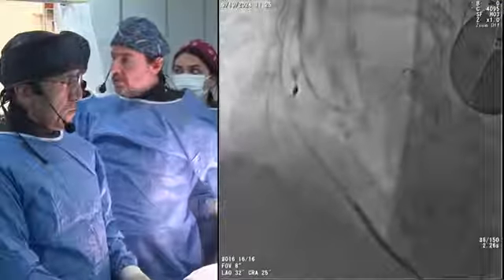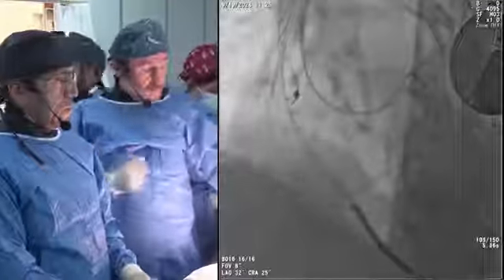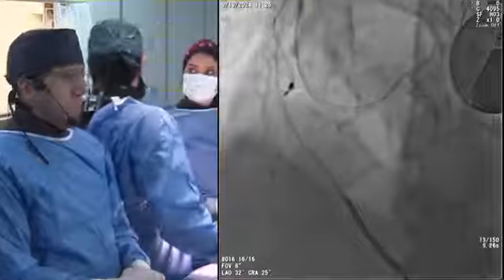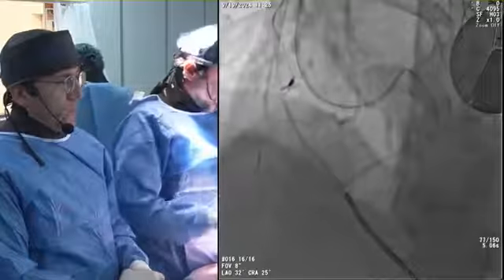And we had some CT images. If we had a CT co-registered device, it could help to show us the exact place of the right coronary ostium. Hey, Baktash, can I say something?